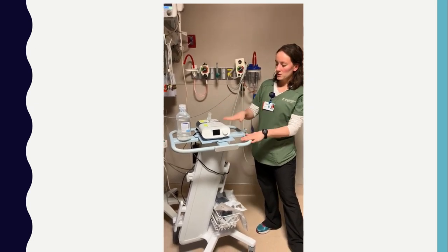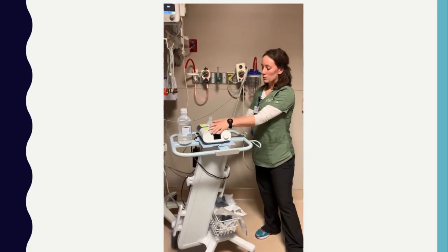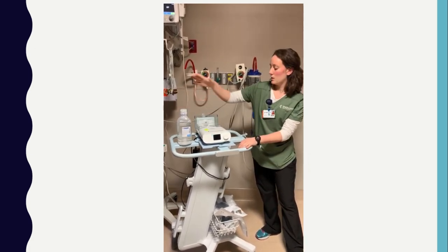First of all, the parts. So this is going to be your actual machine part right here. It's this very front part. And then back here is going to be your water tank. And a really, really important part, whenever you have a patient that's using one of these, you want to make sure that you're using sterile water to fill their water tanks. And it's really cool.